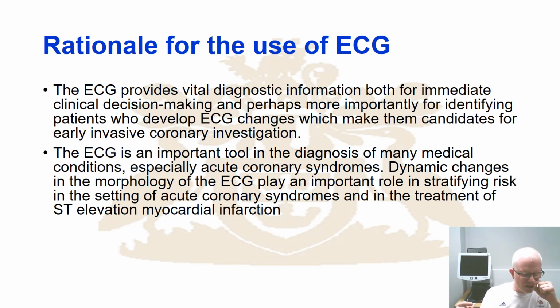And so you can start to deal with things like what's called ST elevation myocardial infarction, heart attack. ST elevation, ST are two of the sections on the ECG trace that we're going to look at. Elevation is what it says, so it's an elevated ST response, so there's a change in the electrical activity in that component. Myocardial is the heart, infarction is what it's referring to, is the attack.